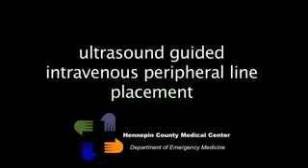Welcome to the HCMC podcast for ultrasound-guided intravenous peripheral line placement. In this video, we will first review the technique for proper peripheral IV placement. We will then outline how to use the ultrasound to improve your success in patients with difficult IV access.